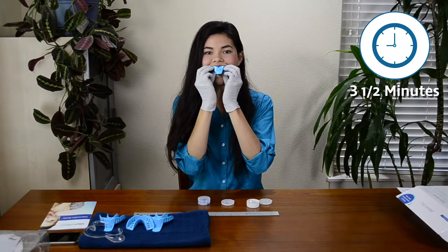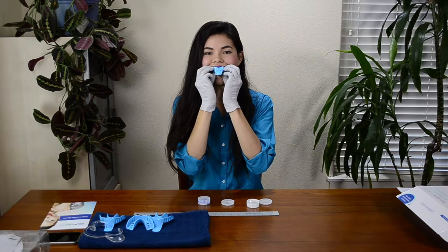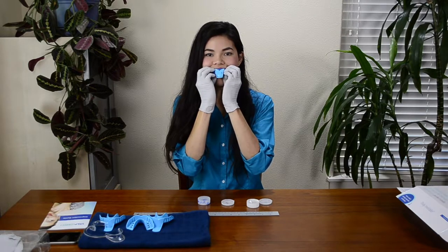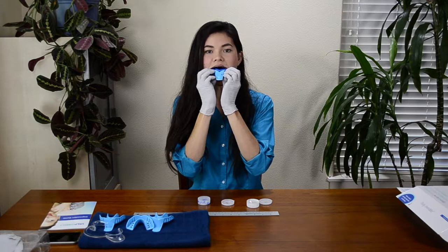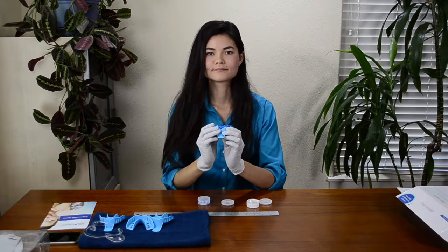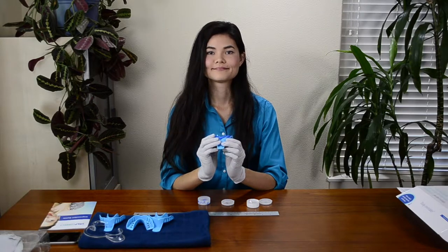When the three and a half minutes are up, use your fingers from both hands to gently pull the tray down until you hear a little popping sound of air entering the tray. Continue to pull straight down until the tray is all the way off your back teeth. Then carefully remove the tray from your mouth.